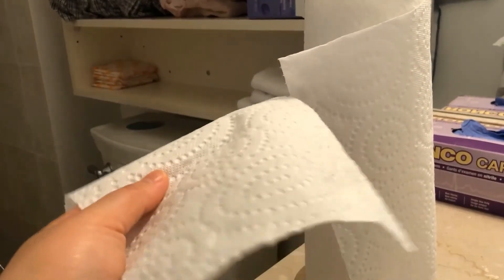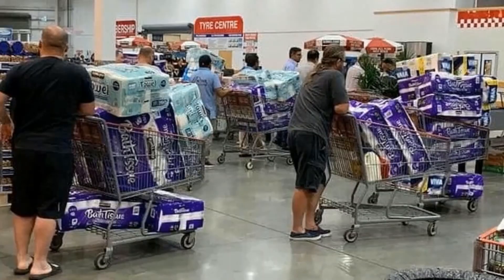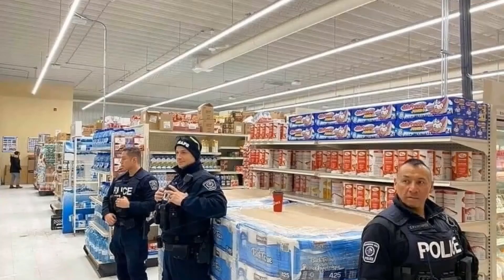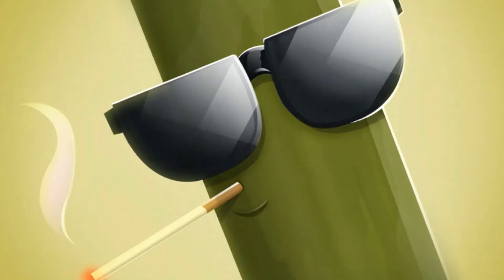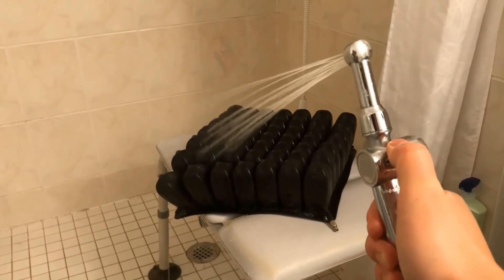After that's done I will use a paper towel to dry the whole area. Remember earlier this year when everyone went crazy over toilet paper? I was as cool as a cucumber because I have not used toilet paper for its intended purposes for years.